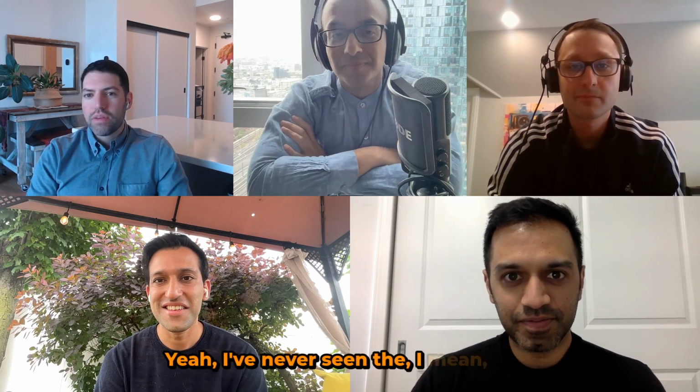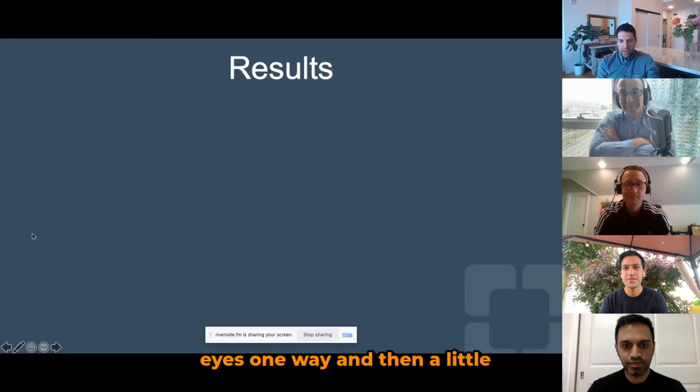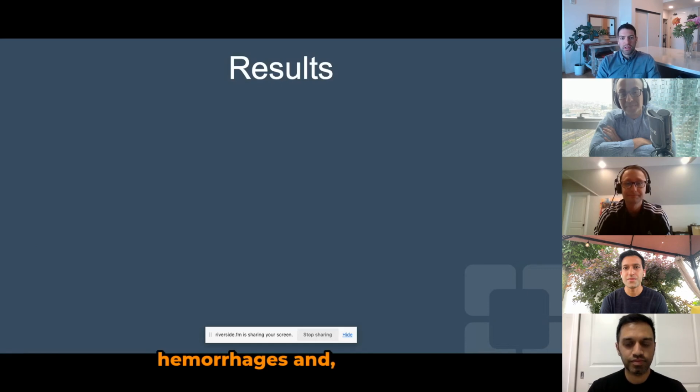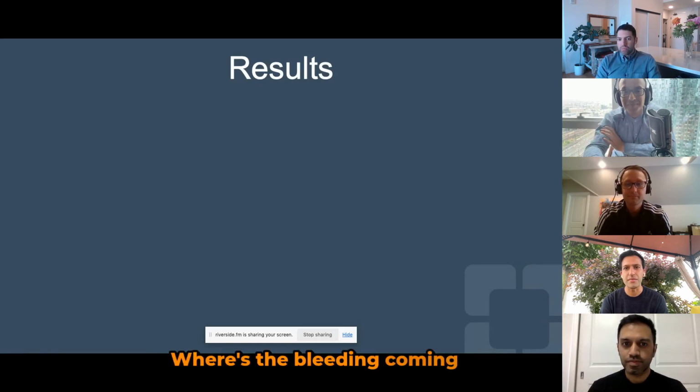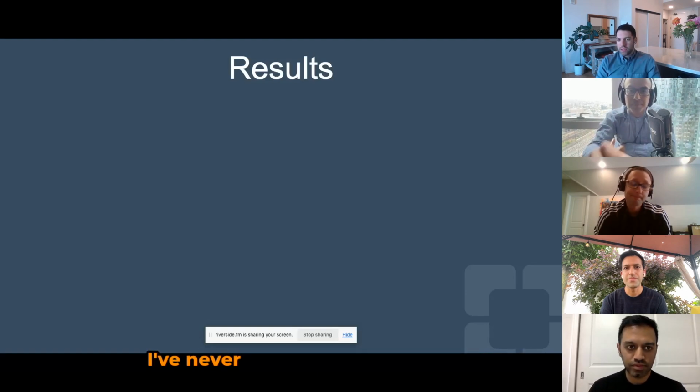All right, so getting back to the case. Danny, that must have been stressful. I applaud you. I've never seen it. I've heard about decompression retinopathy, but I've never seen it live. Eye's one way, then a little hypotony, then boom, you see these hemorrhages. I think it was from the deep venous plexus of the retina. Where's the bleed coming from? I know, obviously, you can get choroidal hemorrhage from hypotony, but I've never seen a subretinal one.